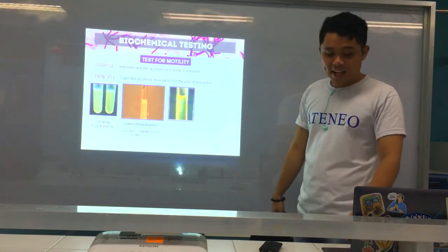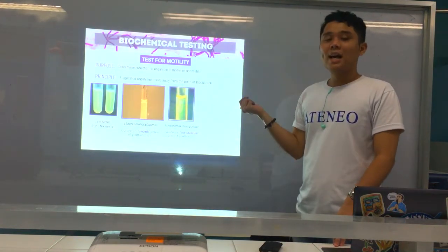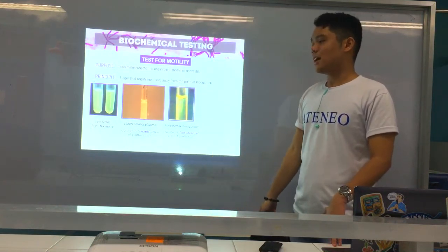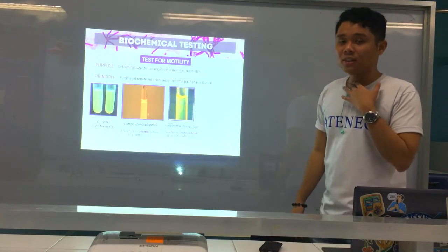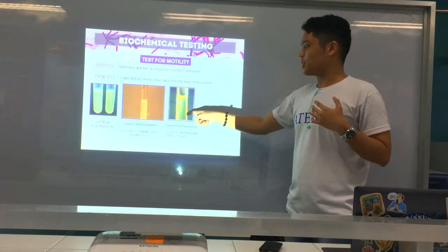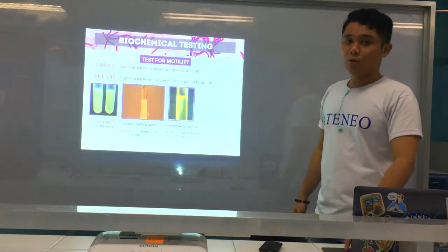Next is you have Erysipelothrix, test tube brush. As you can see, siya test tube brush. But Erysipelothrix is non-motile, guys. Inanira gyud iyang growth sa semi-solid. I don't know why. But again, it's considered non-motile, pero iyang growth is described as test tube brush. Okay. Alright. Still the same at 22 degrees Celsius or at room temperature.